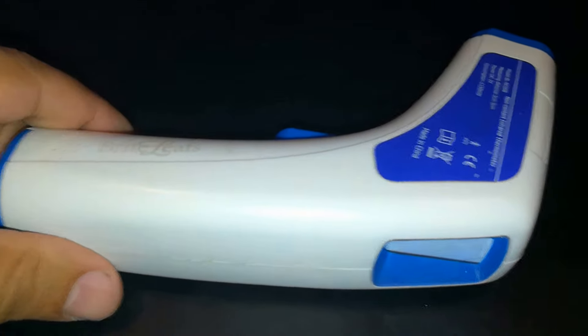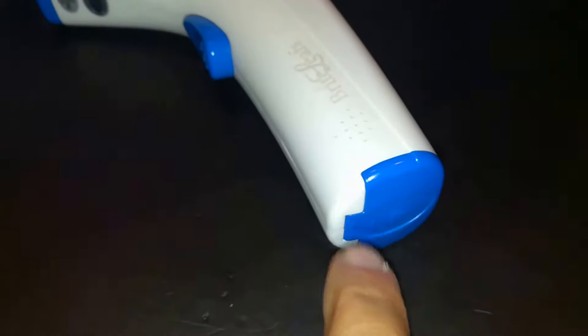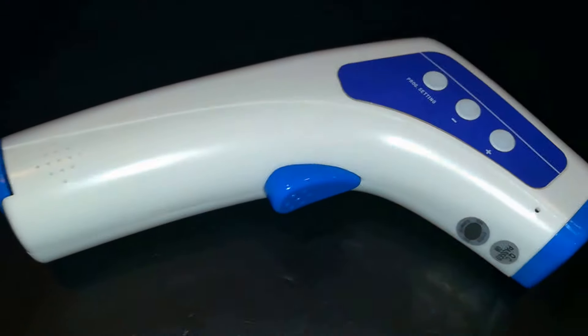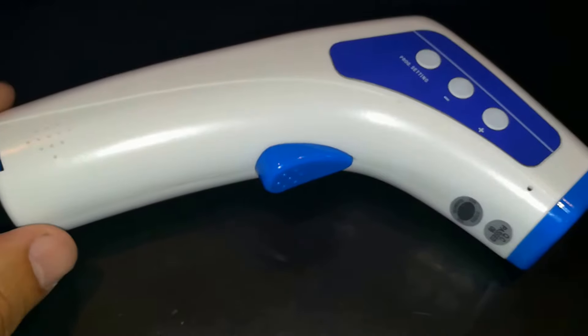And I've had this ever since. The kids play with it, it gets dropped. Even down here the little clip is broken but it seems to keep working. It's a really great thermometer for kids, adults, anybody. It just runs on two AA batteries.